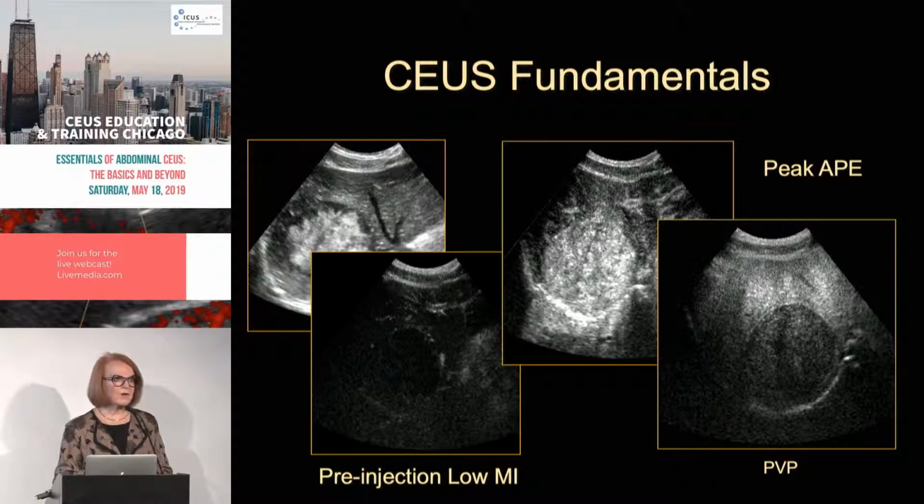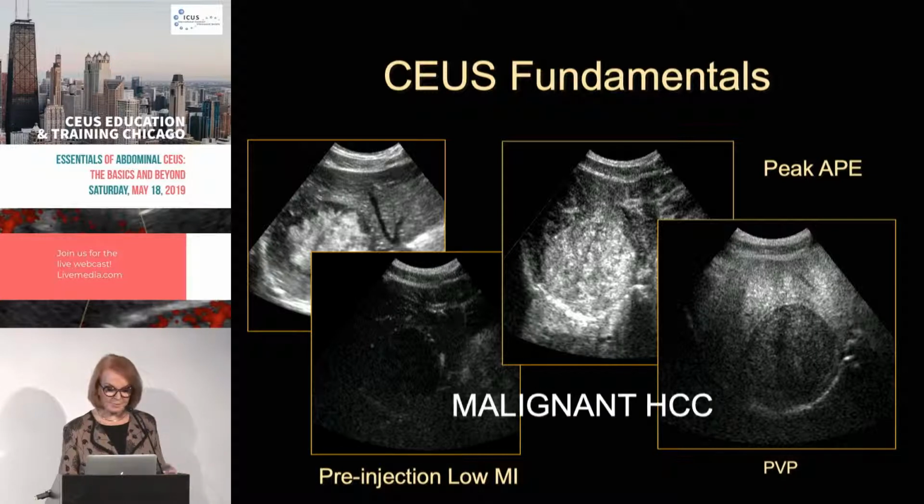And in the portal venous phase, we can now see that the liver, which is perfused by the hepatic artery and the portal vein, has now become brighter than the mass. And the mass looks like it's washed out. And so that phrase that we say, washout, is such an important observation. We can see this here. And again, this is a bubble-only image. So we're looking at bubble images once we inject the contrast on top of a successfully subtracted mass.